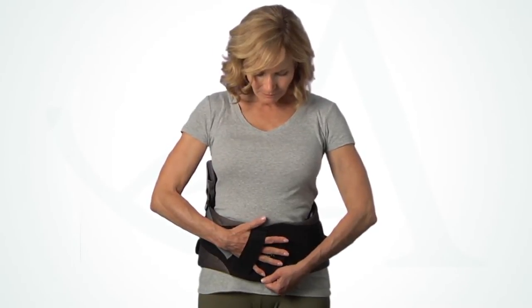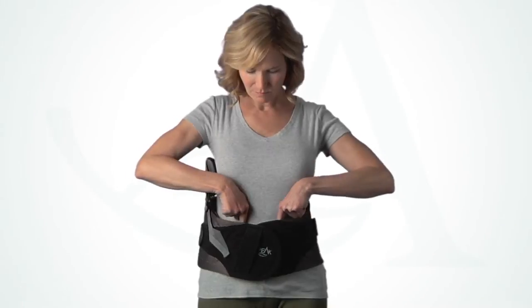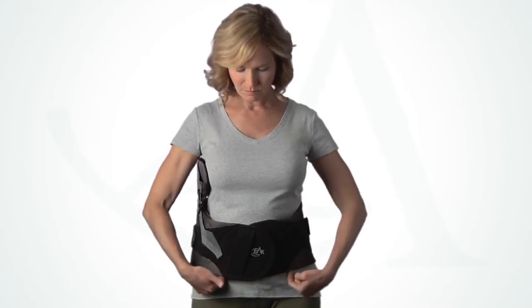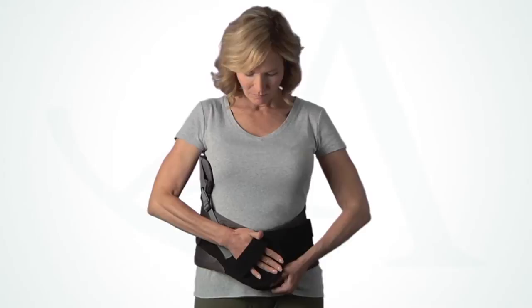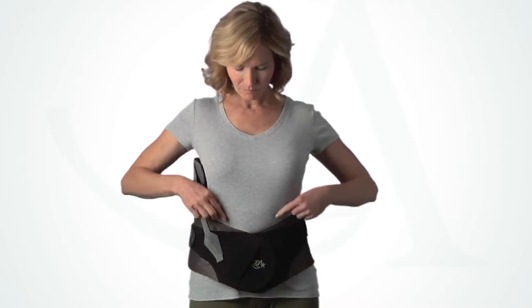Overlap the panels and press down firmly to secure. Before tightening, be sure both the top and bottom of the belt are snug. If needed, angle the ends of the brace to achieve a snug fit at both the top and bottom.